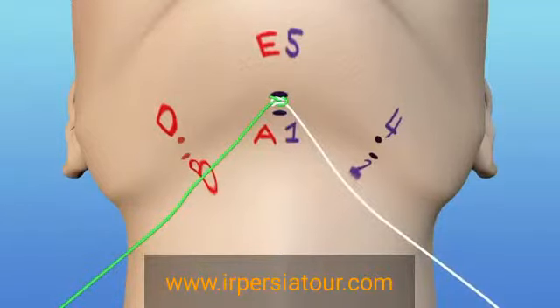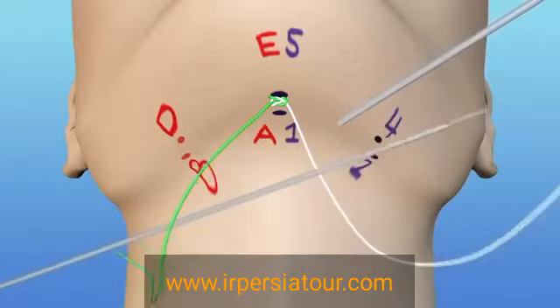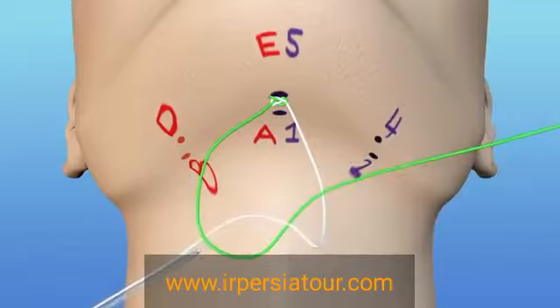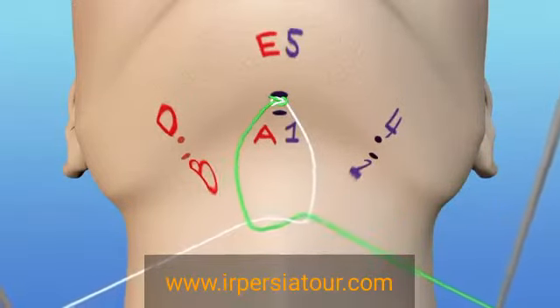I always throw another throw so that I have 3 throws of the knot to further secure the knot in this region prior to completing the remainder of the procedure by proceeding anteriorly and placing the trampoline platysmoplasty.